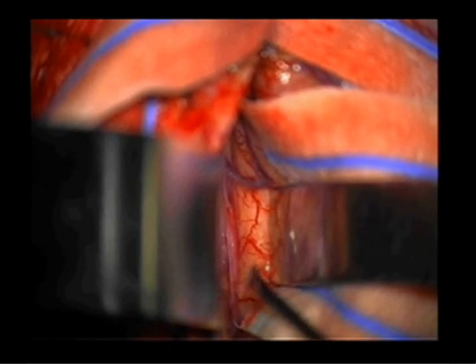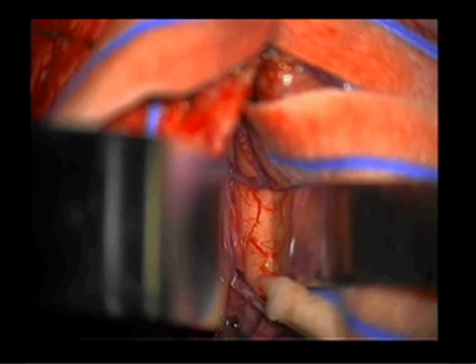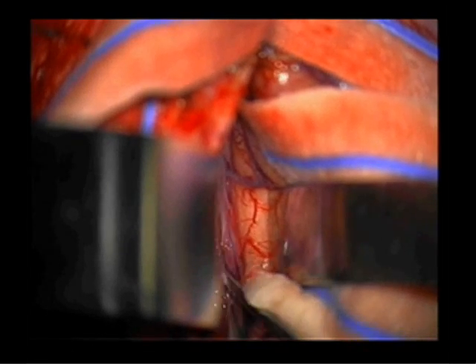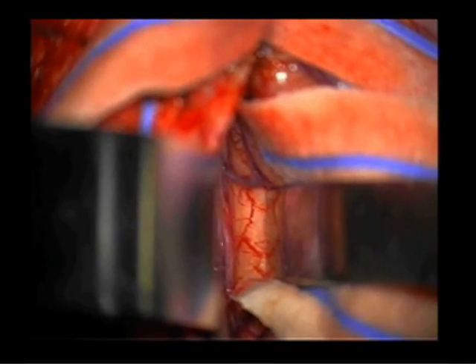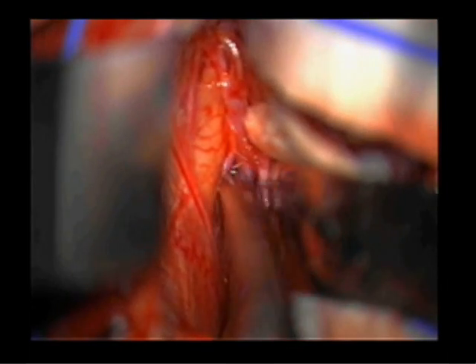It is crucial to preserve all bridging cortical veins posterior to the coronal suture. We find it helpful to place cotton strips or Telfa under our retractors to minimize trauma to the mesial frontal lobes.